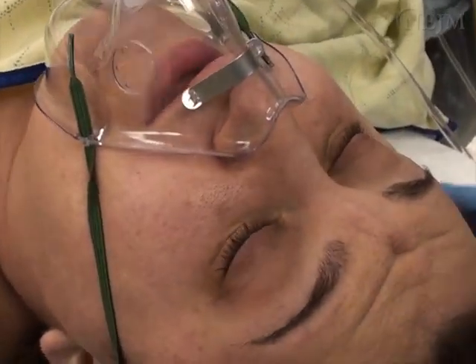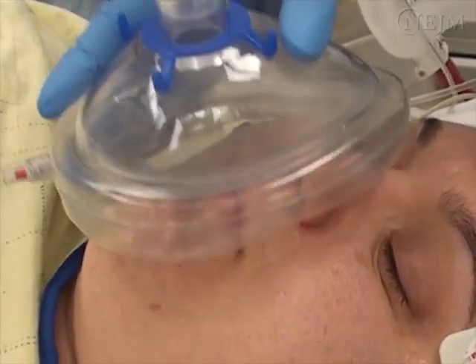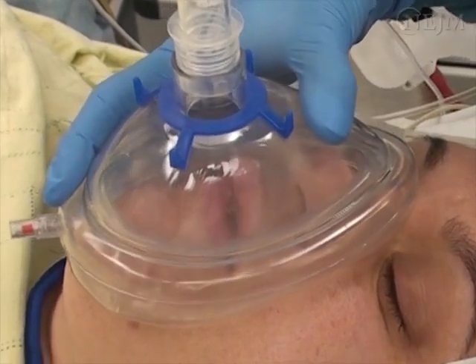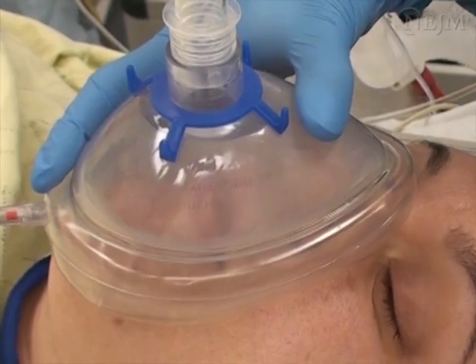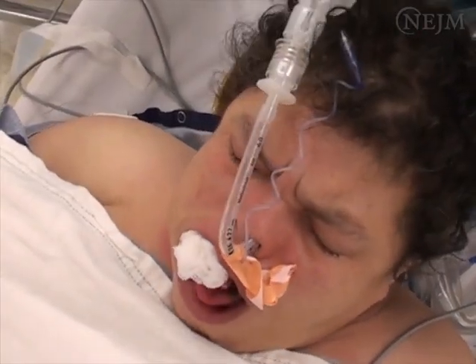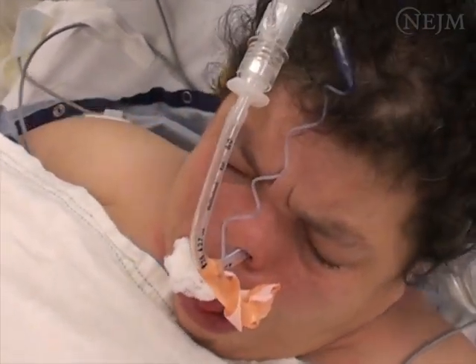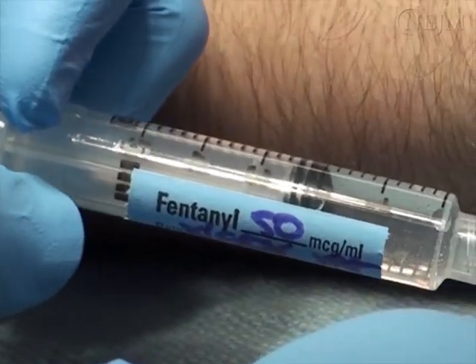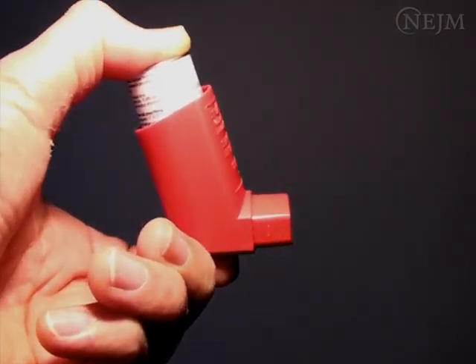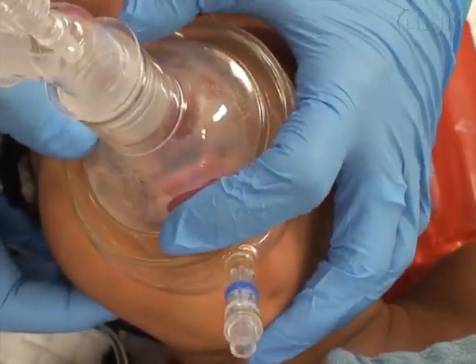Although few extubation-related complications are life-threatening, hypoxemia is the common pathway to severe complications. In the period immediately after extubation, early respiratory insufficiency may be caused by poor ventilation or residual neuromuscular blockade. Bronchospasm and severe coughing can also impair adequate ventilation. Both conditions can be treated with topical or intravenous local anesthetic agents, intravenous opioids, or bronchodilators as indicated. Acute upper airway obstruction may be caused by laryngospasm, especially in children.